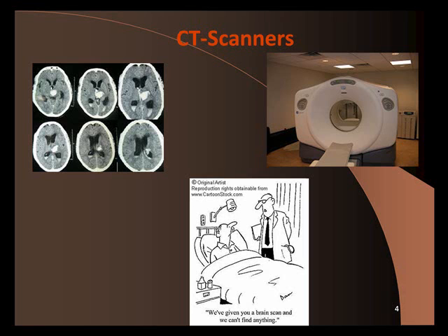It's just to be able to turn the gantry and see real-time X-rays as you're turning the gantry, as you're turning the collimator. Because you don't want to run a film every time you turn a gantry and you say, well, I want to turn a 5 degree. Let's try a 5 degree change. You don't want to go run a film or process a film all the time. So this is just real time. It's basically real time X-rays. That's the advantage of that.